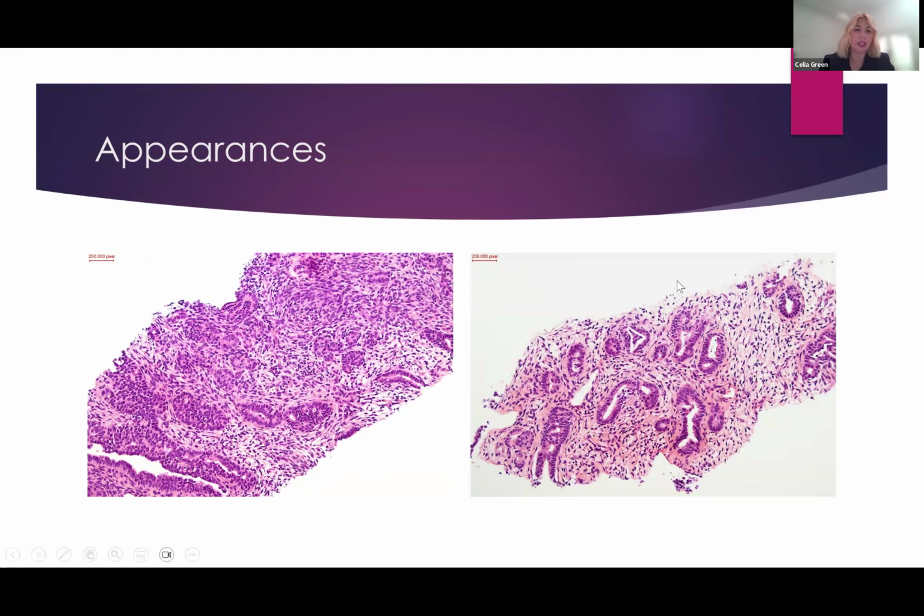So on histology, this is a biphasic mesothelioma, where you've got these glandular formations clearly invading through the fibrous pleura, and this is the spindled component, which is dark, nasty, and forming sort of dark, ugly areas. This is just a glandular or tubular mesothelioma rather, and this is just a reactive stromal response from the fibrous tissue. And this can make it very easy because the stromal response tells you that there's something being incited, because as these move through the fibrous pleura, it's reacting. So, these are the circumstances by which you would look at it and you would immediately say, yep, this is mesothelioma.